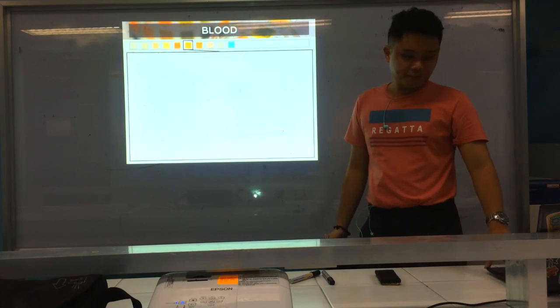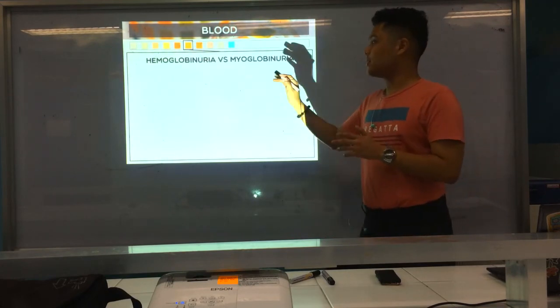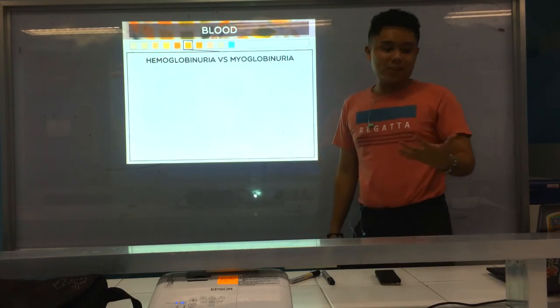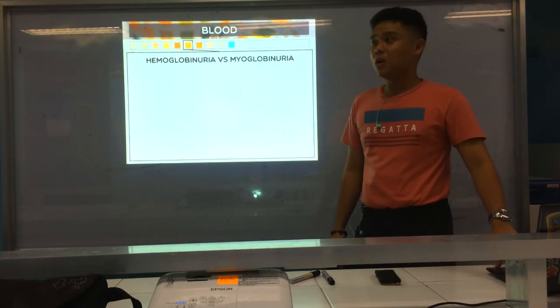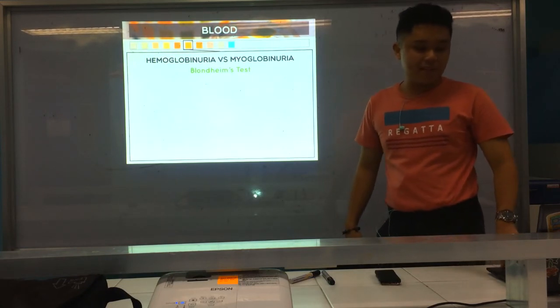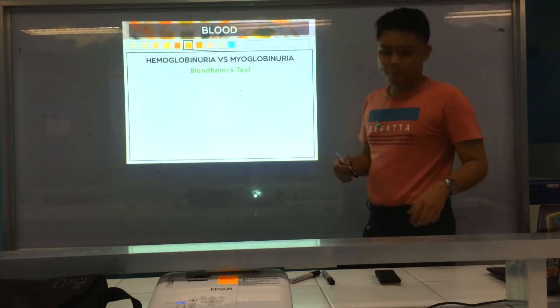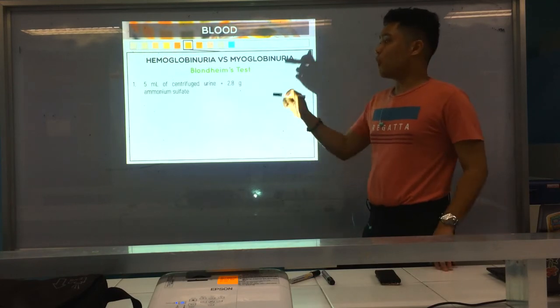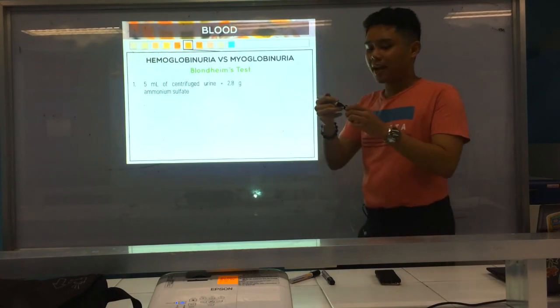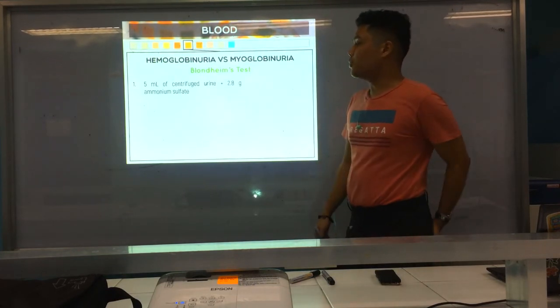Okay? Alright. Ayan. So this is what I was mentioning atong sa physical exam, na chemical test to determine between hemoglobin and myoglobin. This is your Blondheim's test. Now, what's the principle of Blondheim's test? It's precipitation. So, i-add tag 2.8 grams of ammonium sulfate. Please take note. Ammonium sulfate atong reagent to 5 ml of centrifuged urine.